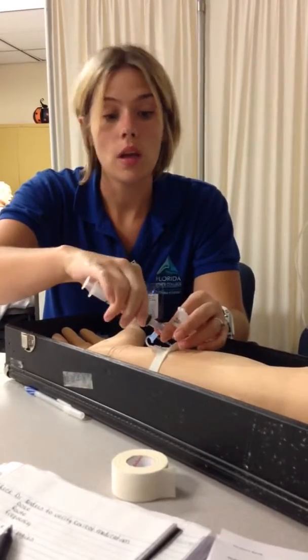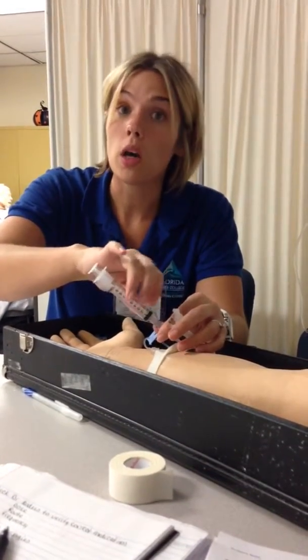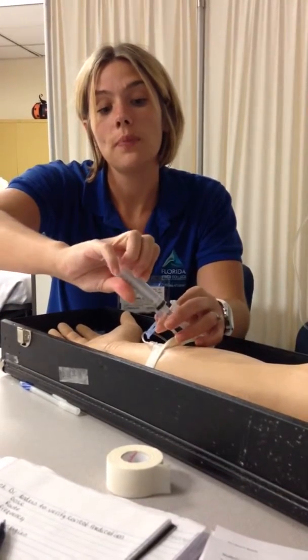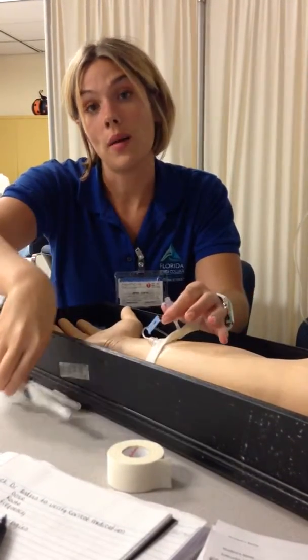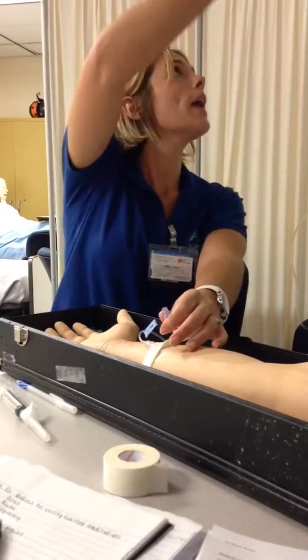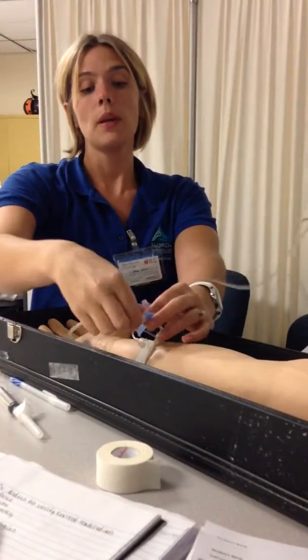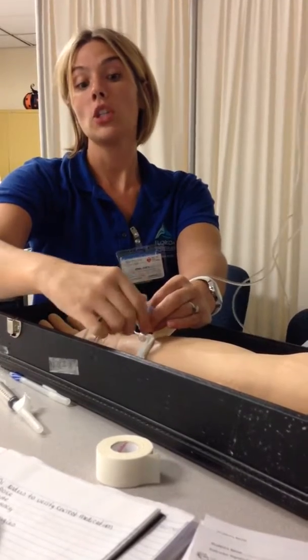I'm also noting that again, there is no heat, no redness, no swelling, no pain. So now it works. That was 3 mLs. Now what I'm going to do is hang on to it. I'm going to keep the other 3 for when I'm disconnecting. Then I'm going to remove my tubing, disconnect my tube. Now I'm ready to start my patient's medication.